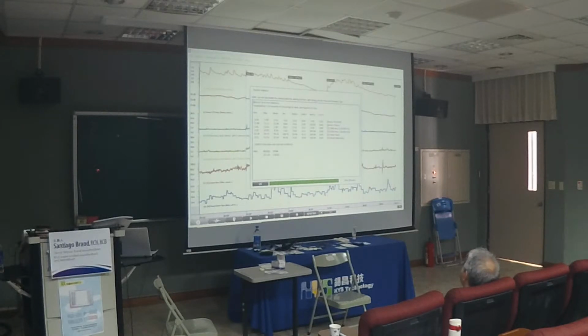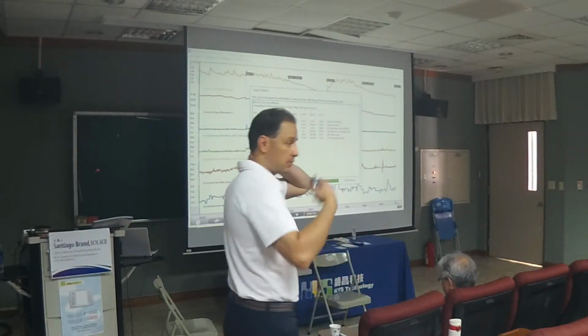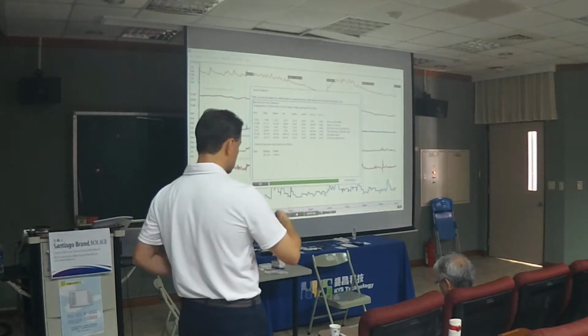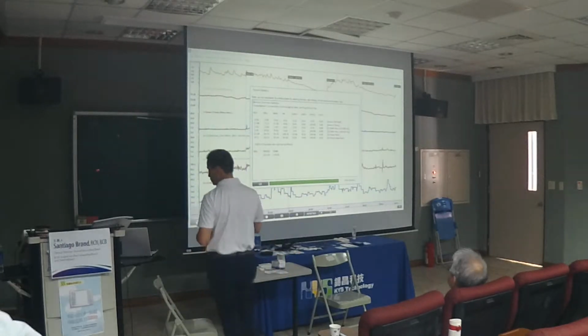4.87 for the neck, which is good. So most people will have reaction on the shoulders. They will have the tension here, and they will relax the neck more. But we'll see as time progresses if that's the case. 72 something the temperature, and I want to bring your attention to that.